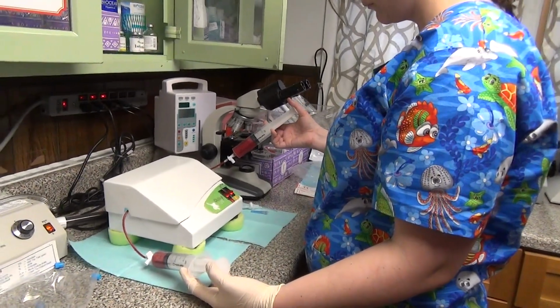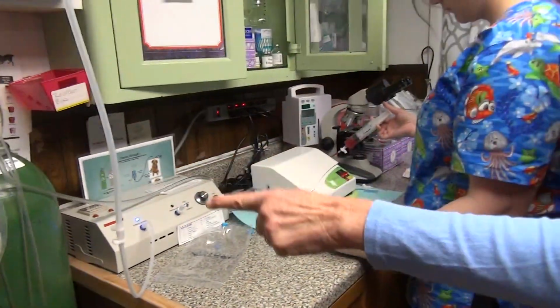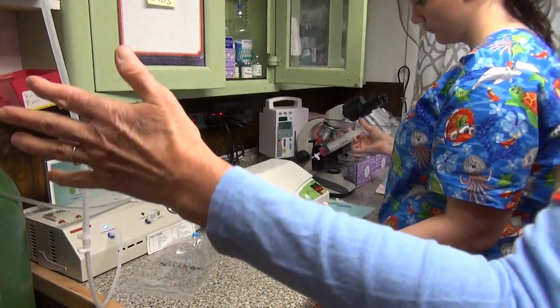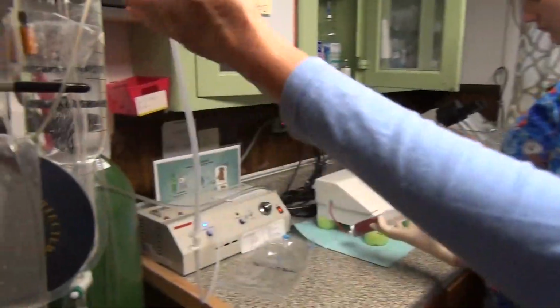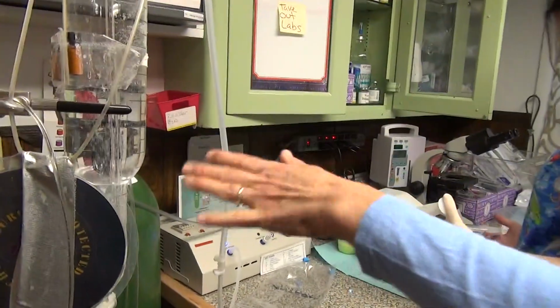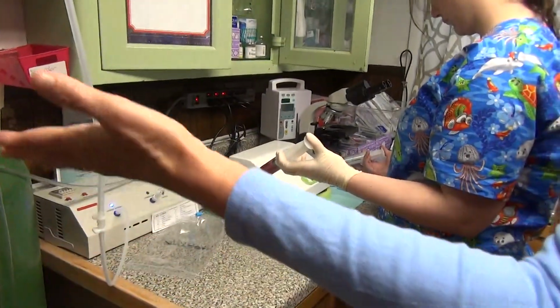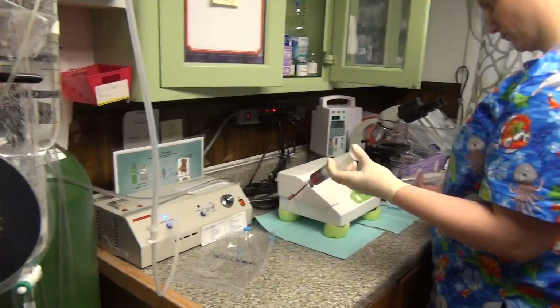And the ozone machine, as you see, we have that running all the time. When it goes off, you want to restart it. Leaving the ozone machine on, or leaving the oxygen running with the ozone machine off, is just breaking up the oxygen and diluting down the saline. So you don't want this running. It's better to shut it off and disconnect it than just have it run with oxygen all the time, because you're actually diluting down the percentage of ozone because you're increasing the oxygen through it.